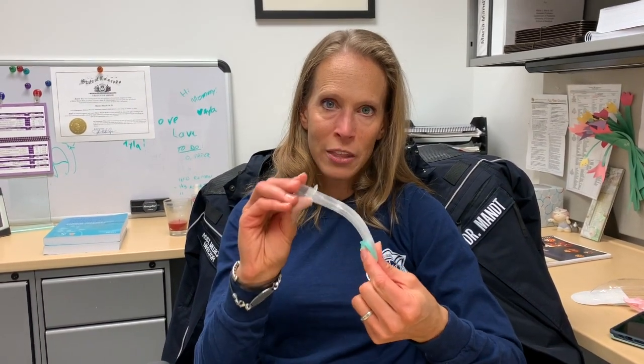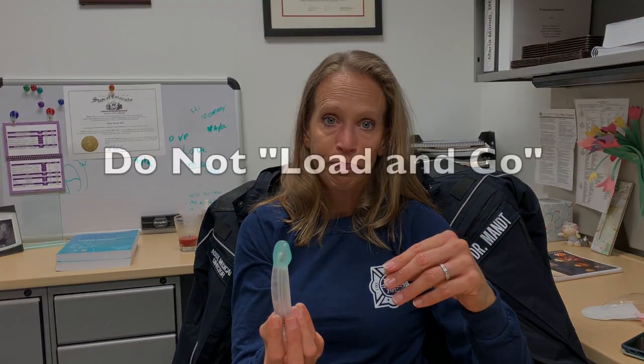These are extraordinarily helpful, allow you to fairly quickly move to doing continuous compressions and ventilations, but we have to keep in mind that it doesn't take much torque on this end to pop this little mask out of the airway. So we have to be very cognizant of disconnecting the bag if you need to let go of the bag for any reason, of supporting the neck with a C-collar if necessary after that I-gel is placed, taping the I-gel to the C-collar to prevent any sort of flexion or extension that can also pop this out very easily.